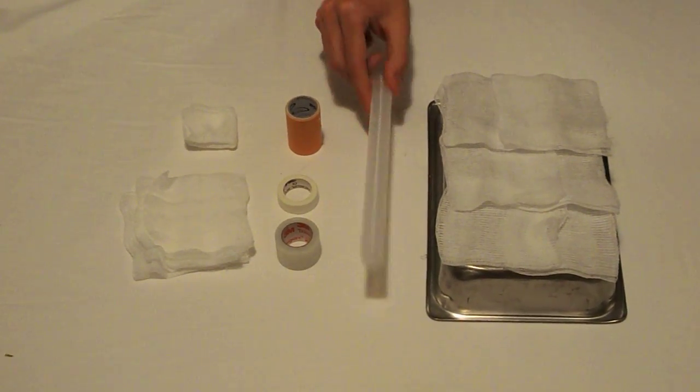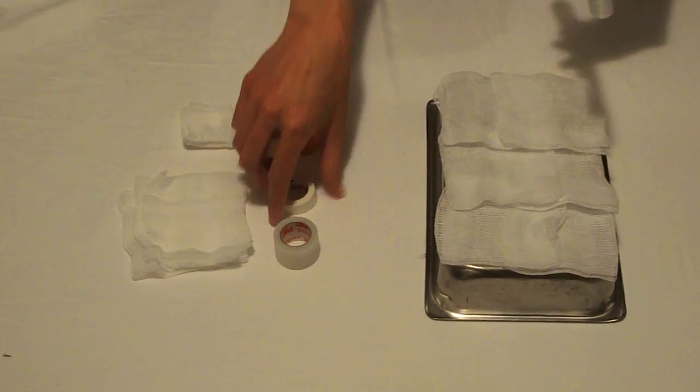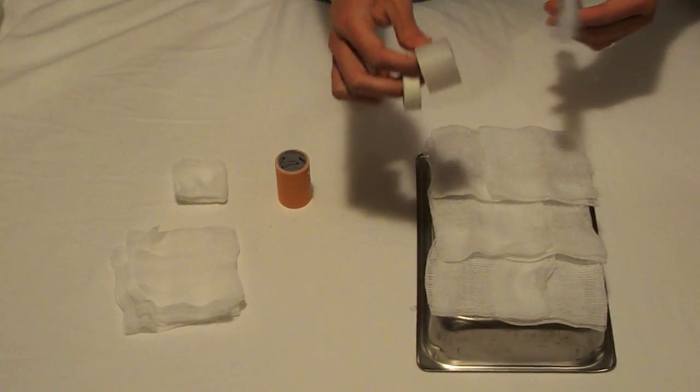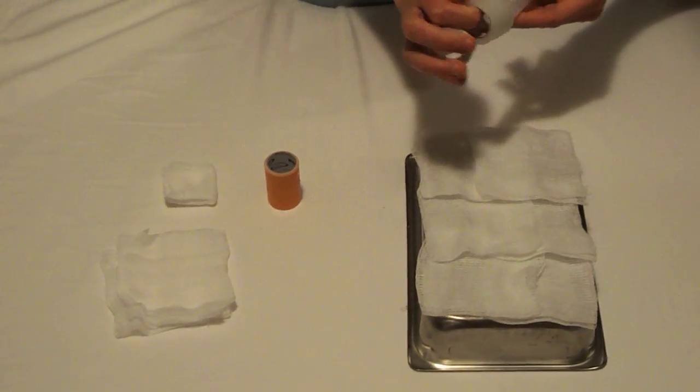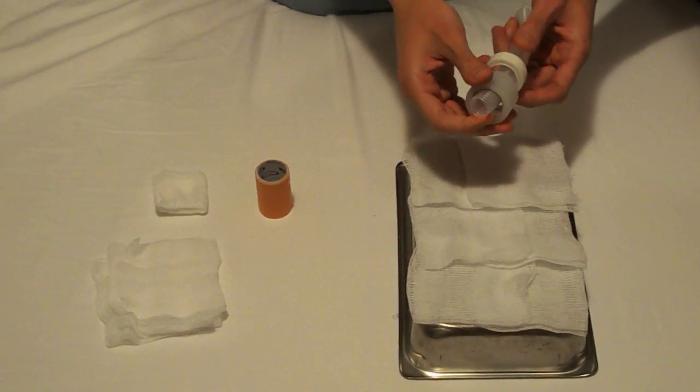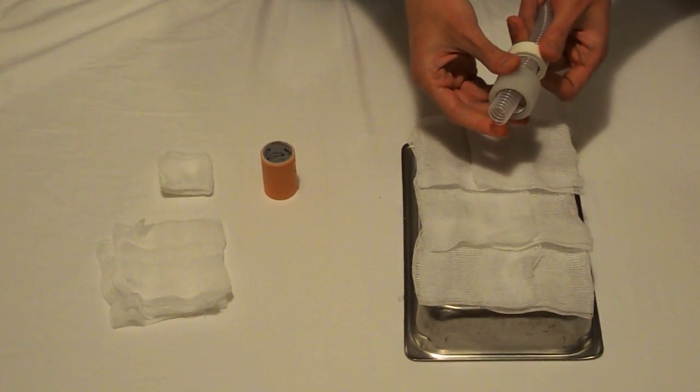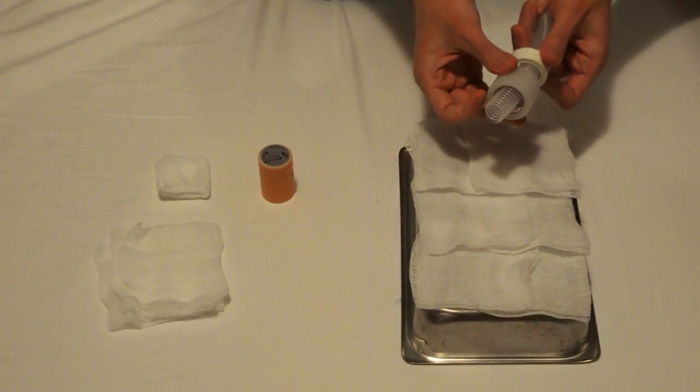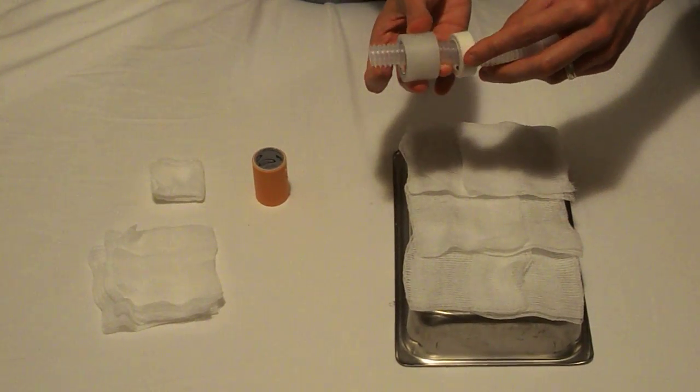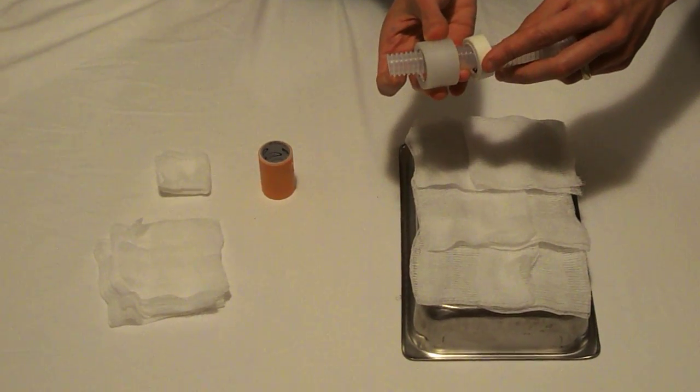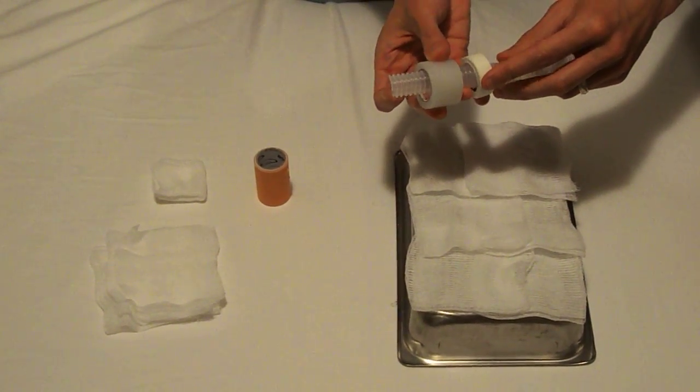Next, take your trachea and your cricoid and thyroid cartilages and place them on the trachea. You'll notice that I took a lot of the tape off both of these rolls to make it so that the trachea will come closer to the surface of the skin to mimic reality a little bit better.